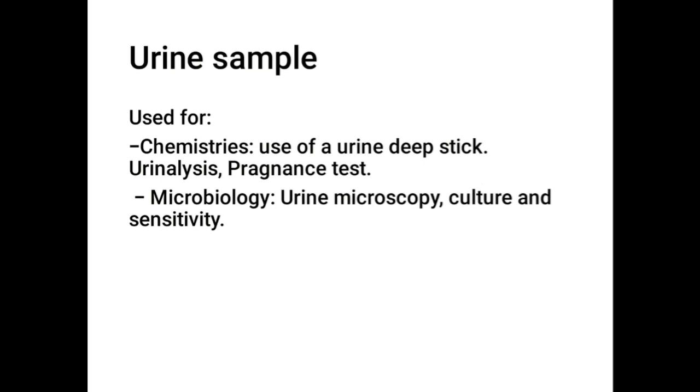Urine sample is used for chemistries, which include the use of urine dipstick, such as urinalysis and pregnancy test. Urine can also be used in microbiology for urine microscopy, culture, and sensitivity. In urine microscopy, we see epithelial cells, cellular casts, white blood cells, red blood cells.